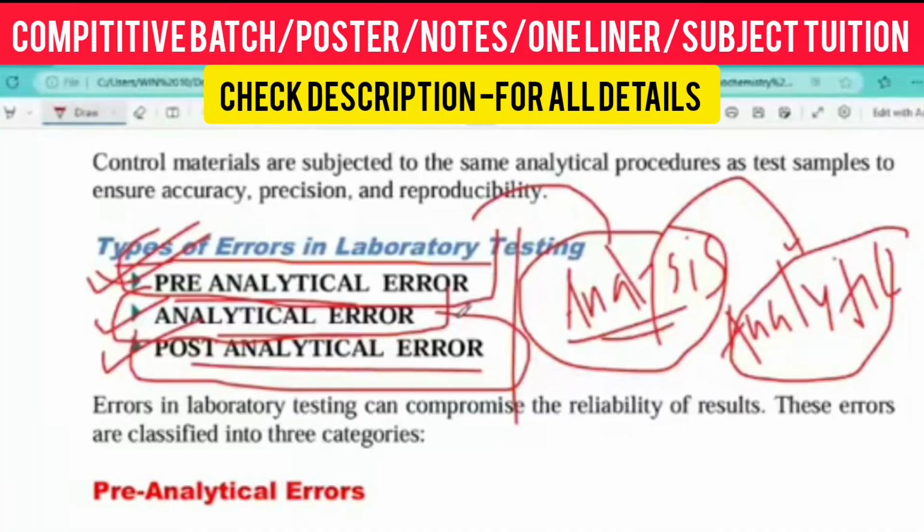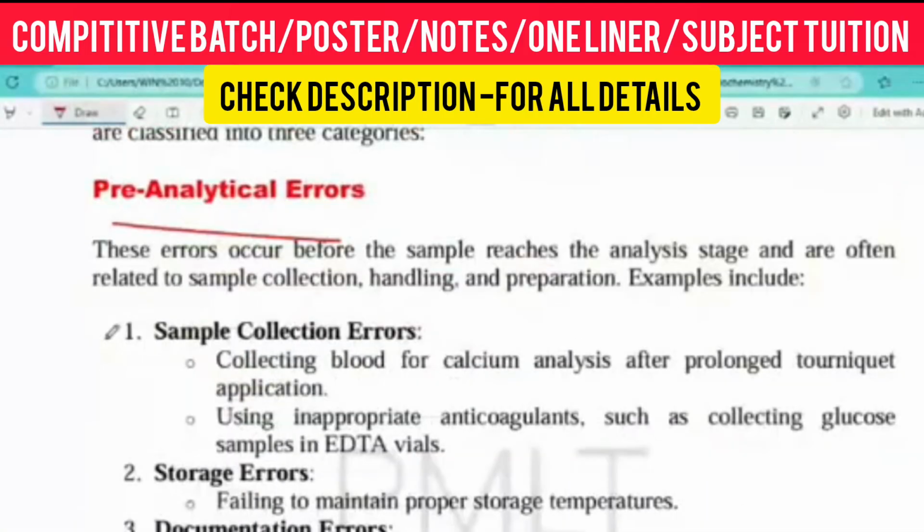Okay, see, pre-analytical error might be sample collection error. Whenever you are collecting the sample, if you are not collecting it in a proper way, then it might be defective, or it might be one type of error. If you are collecting a sugar sample in an EDTA vial, that is also one type of error. If you are collecting the sample with a tube that binds calcium, it is also one type of error. Firstly, sample collection error, because without sample collection we cannot move to the analytical section, right? So sample collection is required.